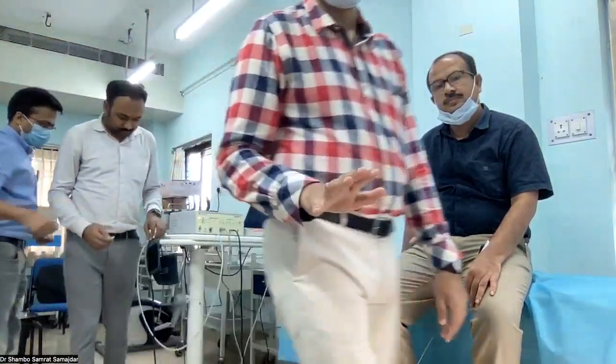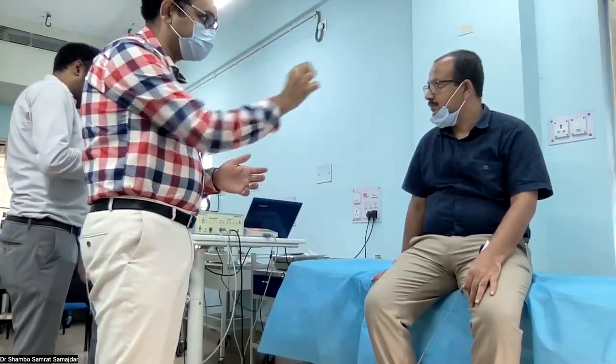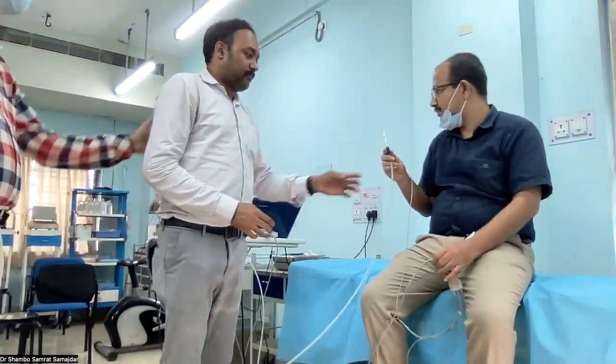And ideally, when we are doing Valsalva maneuver, there are some machines that also include one clip to block the nose. So there should not be any leakage from the nasal sides. So let's first explain here.